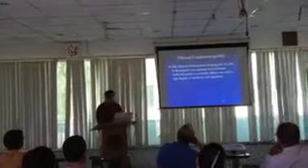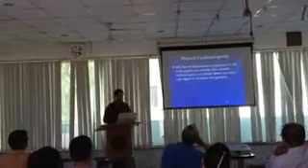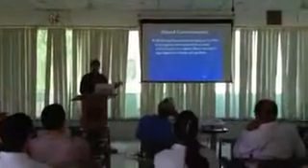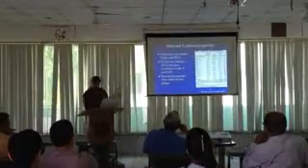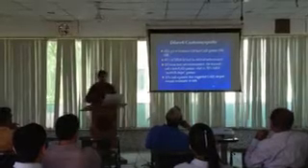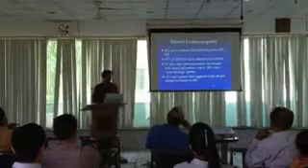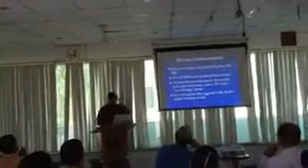So again, you look at the delayed enhancement only. It helps in differentiating between ischemic and non-ischemic, and it reliably detects the scar with a high degree of sensitivity and specificity. You will have a scar here also, but the pattern of the scar will be different. That is what we will see. So all patients with ischemic cardiomyopathy had a delayed enhancement, which conforms to a vascular territory which is subendocardial in distribution. It is associated with wall thinning and wall motion abnormality, that is ischemic.